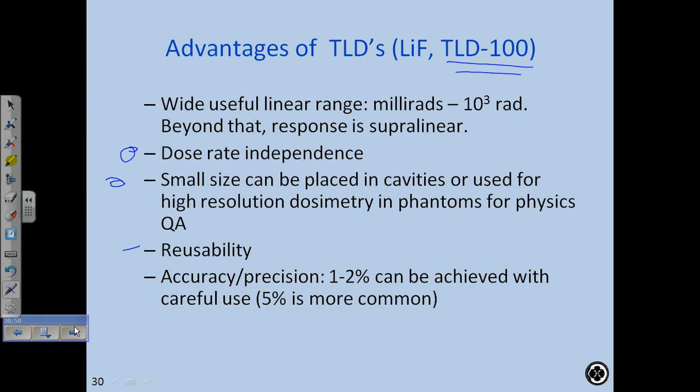The thing is, it's very, very technique based. So every time you anneal them, and every time you get a chip factor, you've got to keep track of the chips and their factors. If you've got chips where the factors are fluctuating up and down every time you anneal them, you should probably toss it, because you don't want that. You want a chip that's always going to keep the same factor. This is all very time consuming, and it's very technique based.